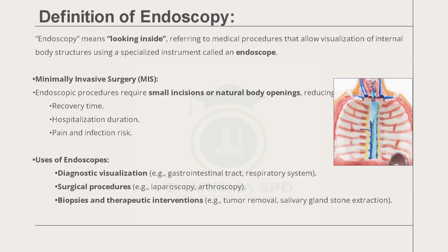Salivary gland stone extractions. Kidney stones too: when you have stones in your kidney, they use the endoscopes to go in, watch, and crush those stones so that the pain that you are going through will go out. You'll be relieved of that pain.